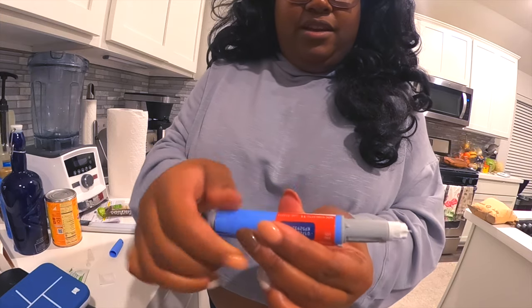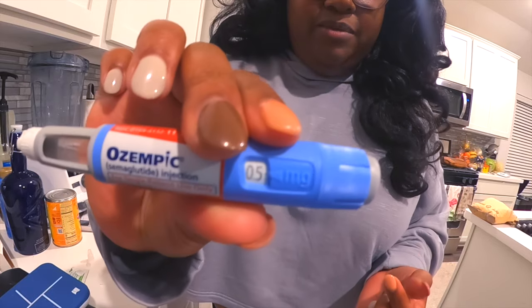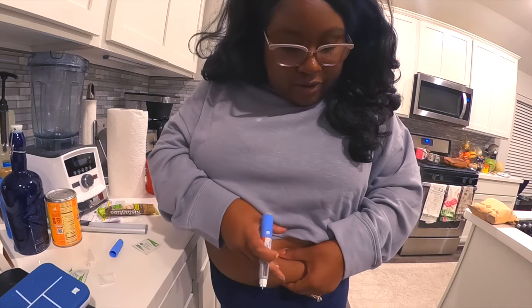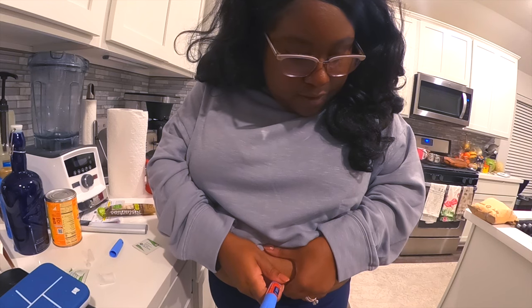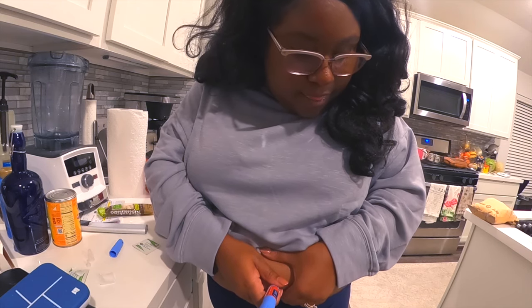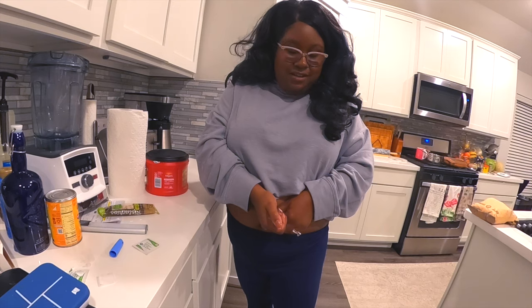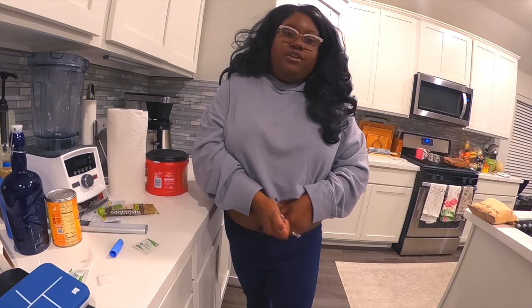I take the highest amount — 0.5 milligrams — so I turned it to that, and then I'll grab a little fatty area of my stomach and inject. Let me get back a little bit so you can see. That's the whole thing, and then you hold it there for six seconds.